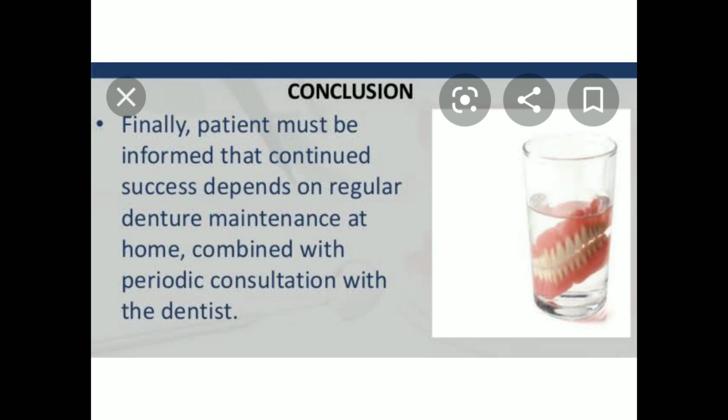Remember, a complete denture's success always depends on a satisfied complete denture patient. If the patient is satisfied with his denture, if he uses his denture properly, if he eats with the denture properly, automatically the denture is a success.